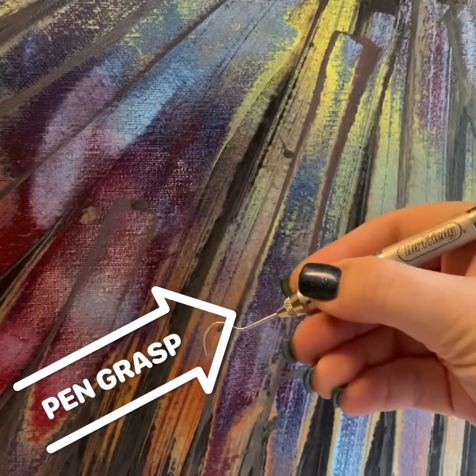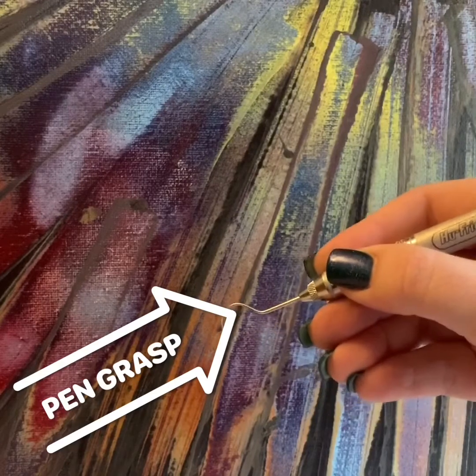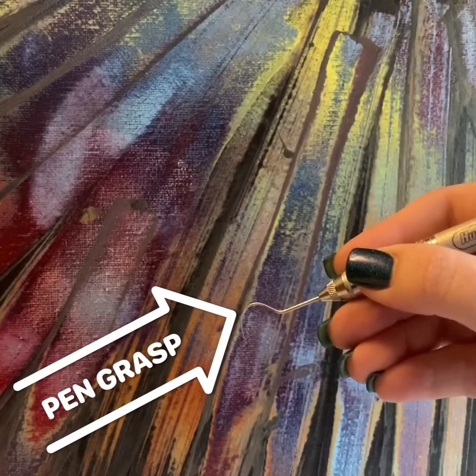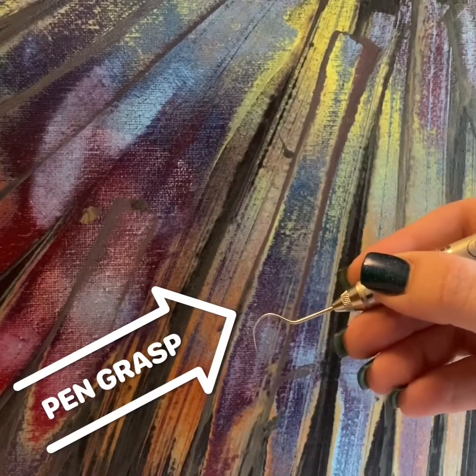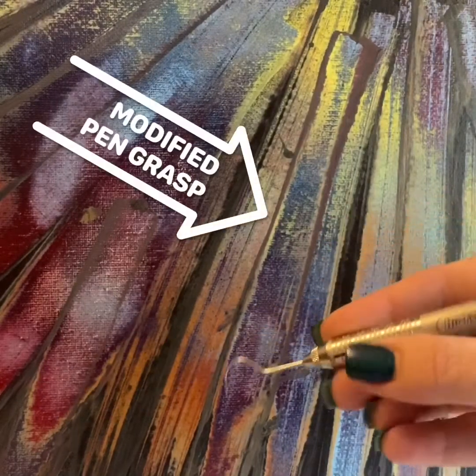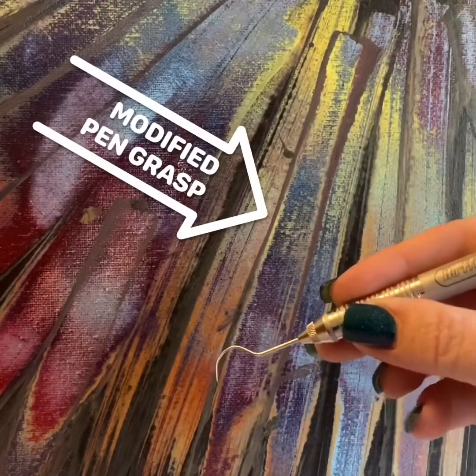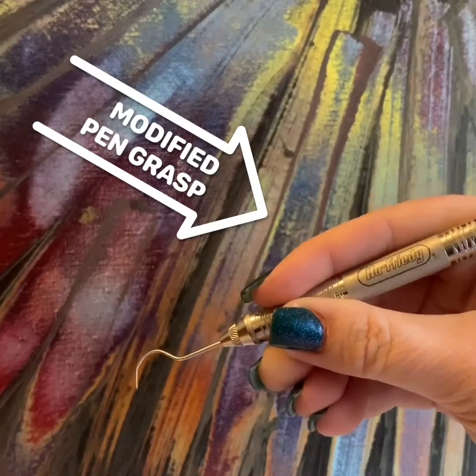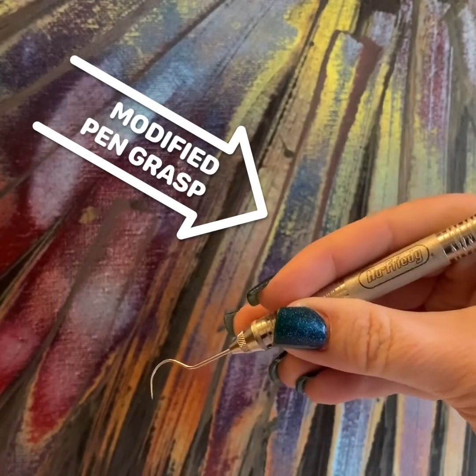The modified pen grasp is similar to the pen grasp. The instrument is held with the same fingers as the pen grasp, except the pad of the middle finger is placed on top of the instrument with the index finger. Like so. So pen grasp, modified pen grasp.